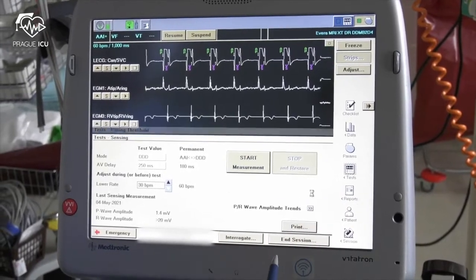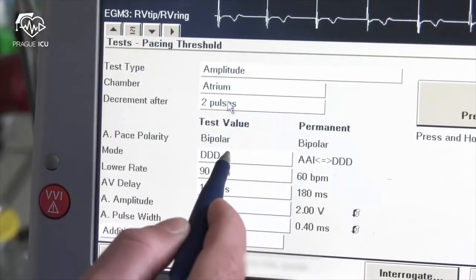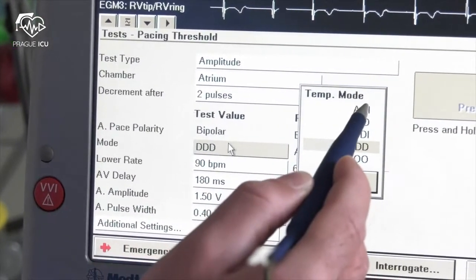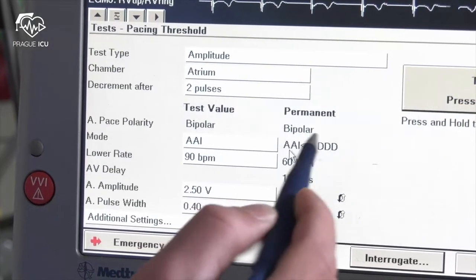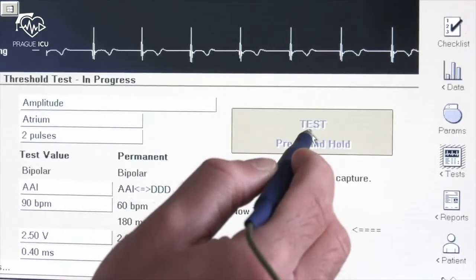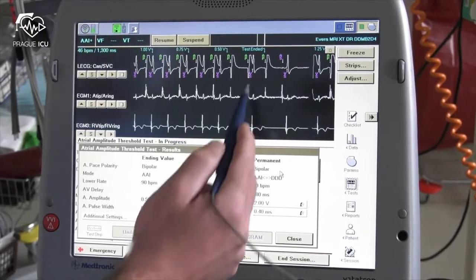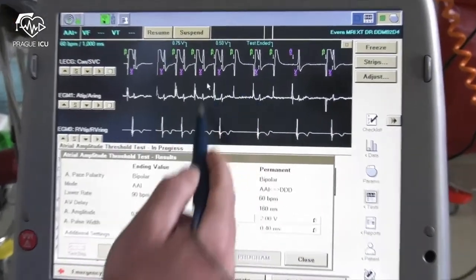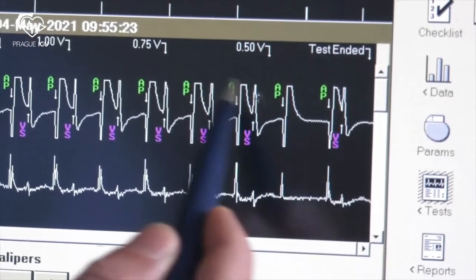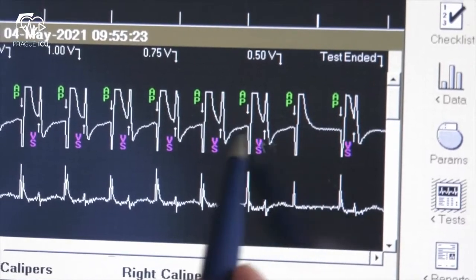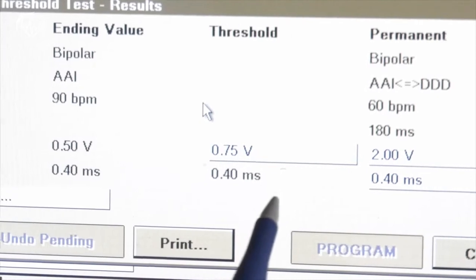For threshold measurements go to test and pacing threshold. Choose which chamber you want to test. For atrial threshold choose pacing mode AAI, or DDD mode in a pacemaker-dependent patient. Then select sufficient amplitude and press and hold the test button. In the upper part of the screen observe the pacing test and release the button when you see no capture in the atrium. Then choose and save the proper measured value.